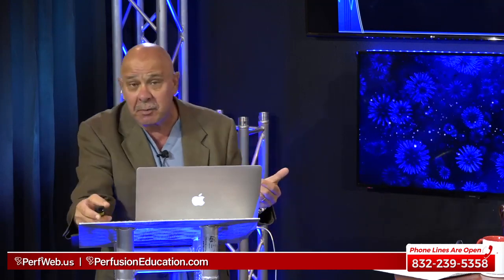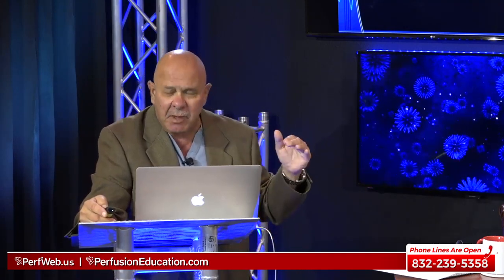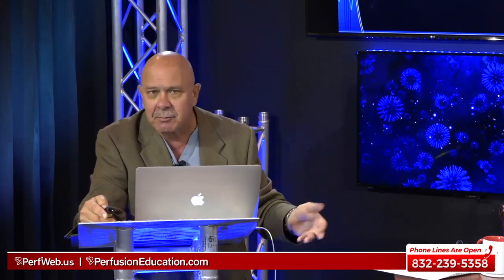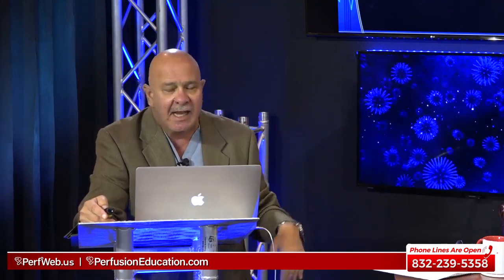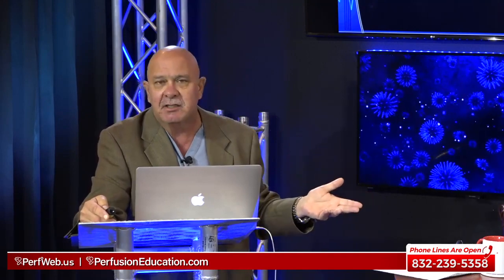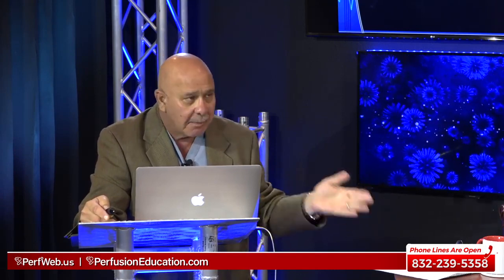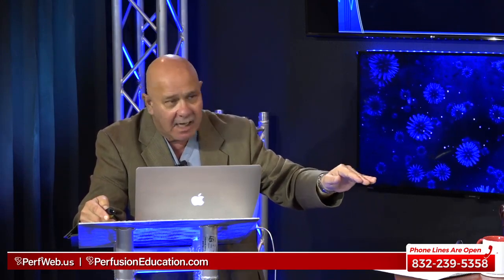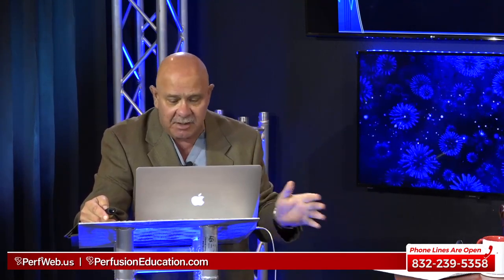And I see this on cardiopulmonary bypass, in fact. If I'm flowing 4 liters a minute and I have a blood pressure of, let's say, 40, because I just gave cardioplegia, or I put some mannitol in, or whatever the cause was that caused that blood pressure to go down to about 40, my SVR dropped, and I have a level in my oxygenator of 700 cc's, 800 cc's, whatever it might be. When I bump them with some Neo and that blood pressure comes up, if I keep the flow the same, I can see the level in the oxygenator rise. So I've validated that this is actually what does occur.